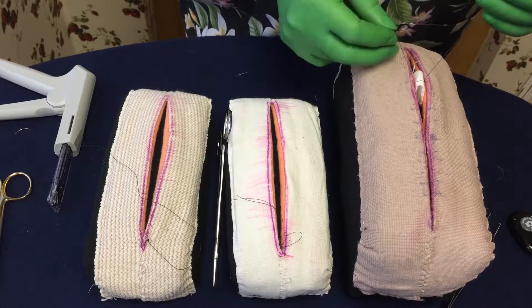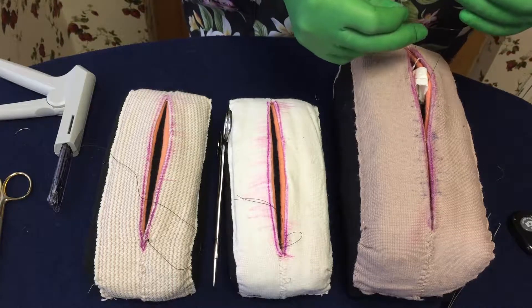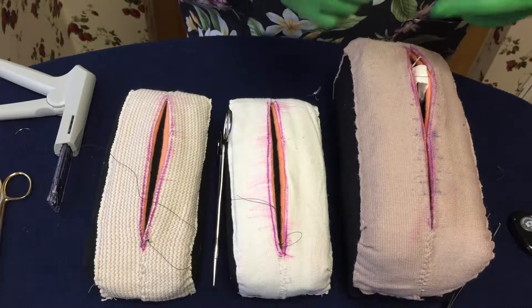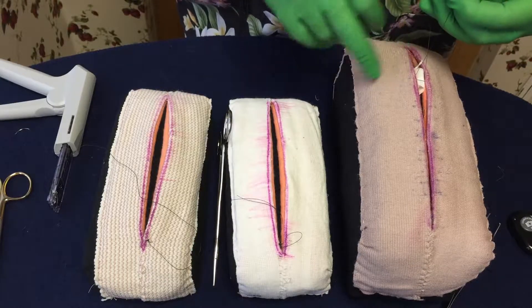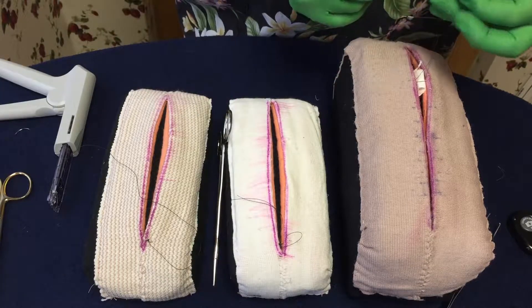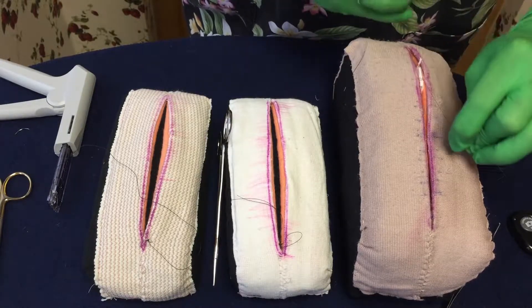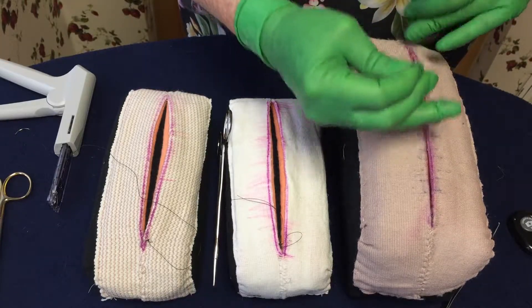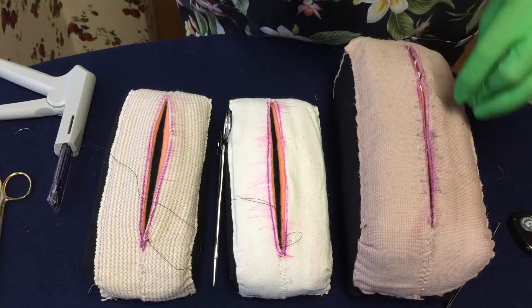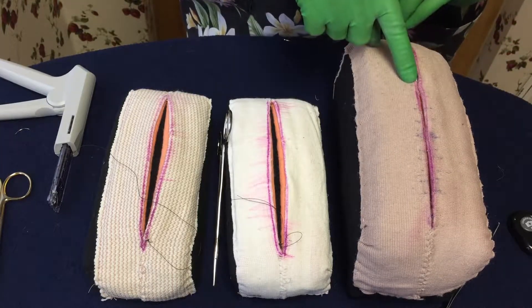You're going to need to tie under tension, which means you're going to need to keep tension on one of them, but you're going to lift up on both of them. As you lift, it's going to be extruding tissue, and if this was really human tissue that's a little bit slippery, it would fall down inside. So you lift up as you're tying, and the extruding tissue gets pushed underneath. Keep tension on one of the sutures. Now that you've got the second knot, it doesn't matter. That's how you deal with extruding tissue.